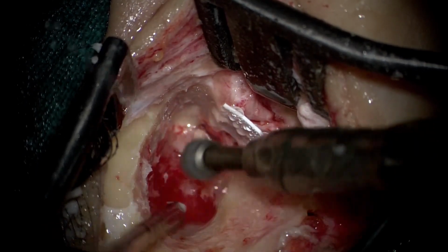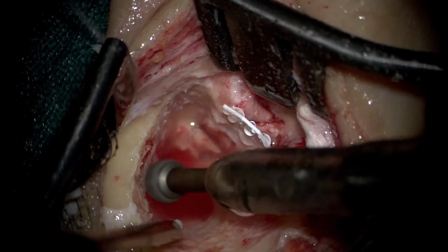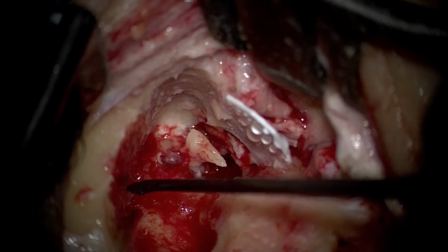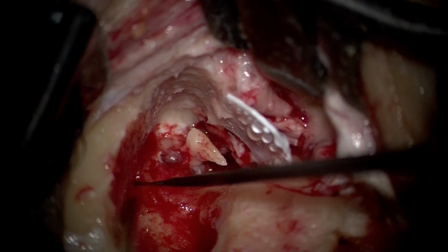Though we know it's a cholesteatoma sac, it's still a good practice to send for histopathology, but we also make a point to send some granulations and the diseased mucosa just in case one accidentally encounters a granulomatous disease of some kind.